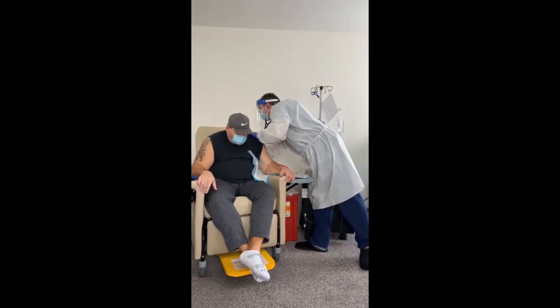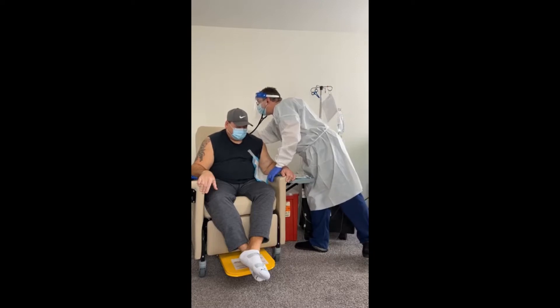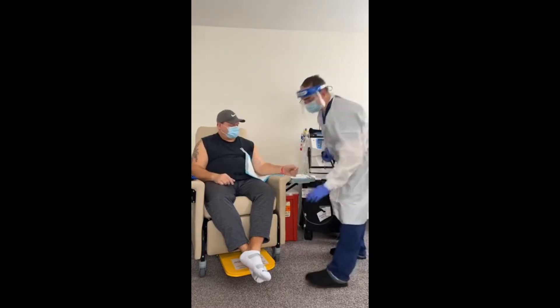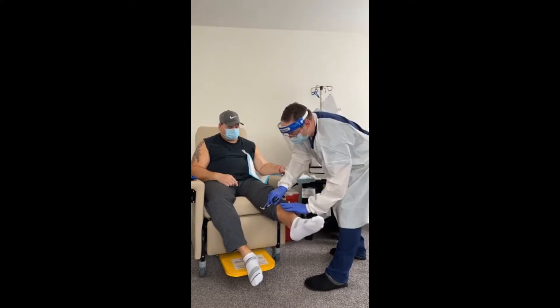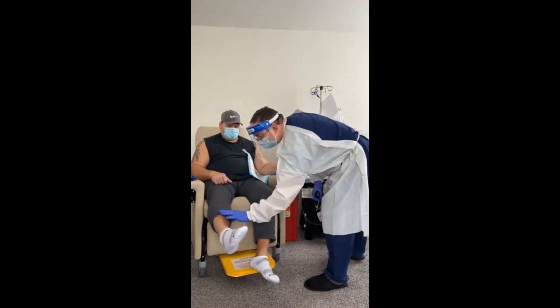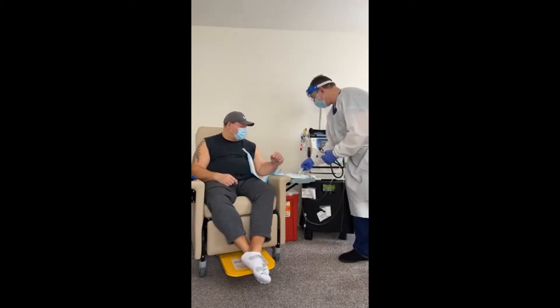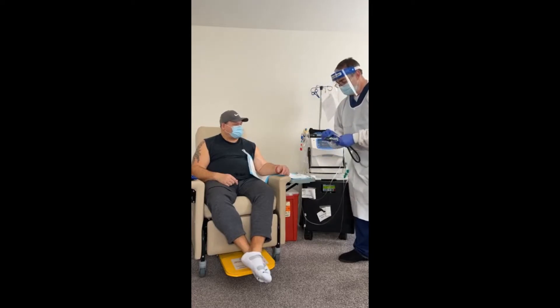Nice deep breath. When we check for swelling, always check on the bone. No swelling. Go ahead and clean this — I'll show you what we're about to do today.